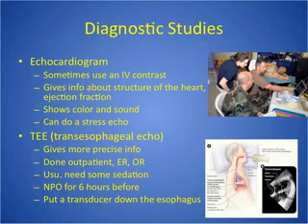And we can also do a stress echo. With a stress echo, for people that really can't exercise on a treadmill, we can give them an injection of a drug, which will speed up the heart, raise the blood pressure, and then see how the heart responds to that. So echocardiograms really tell us about wall function. In terms of an MI, they don't do it to determine where an MI occurred immediately. After they've been diagnosed with a heart attack, they might do an echo to see how well the walls are functioning. So it's not usually done to diagnose a heart attack.